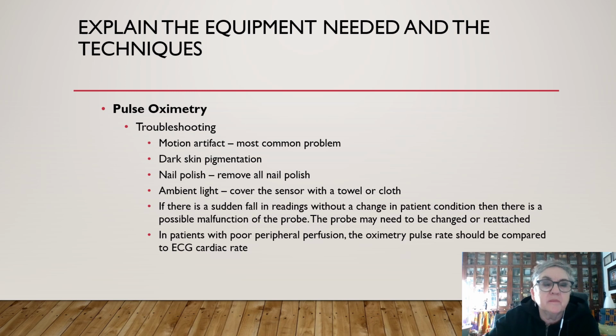In troubleshooting the pulse oximetry, motion artifact is the most common problem. Dark skin pigmentation can also cause errors. Nail polish: you must remove all nail polish before attaching the probe. Ambient light: you can cover the sensor with a towel or cloth.